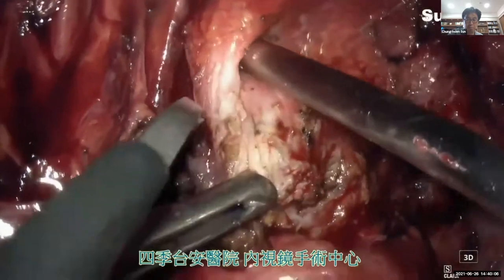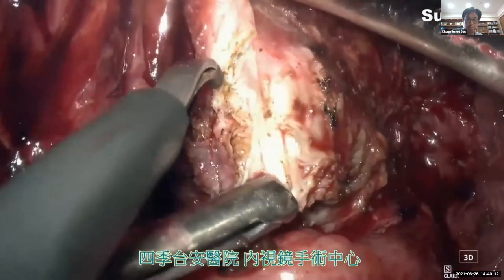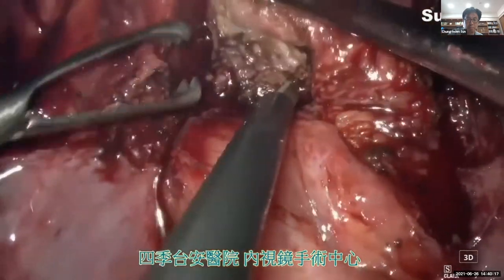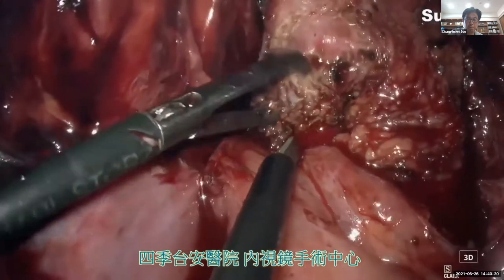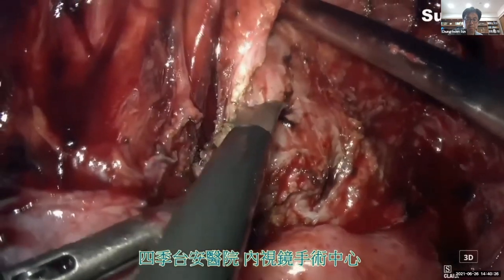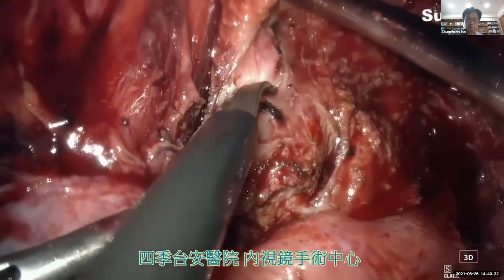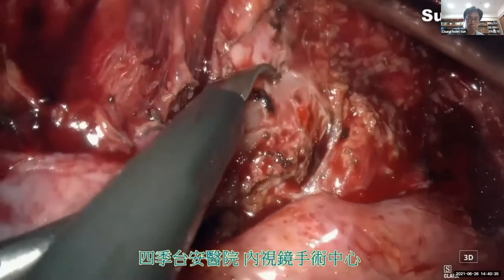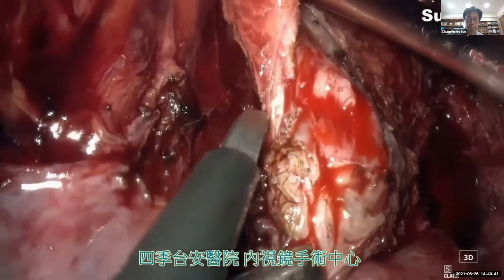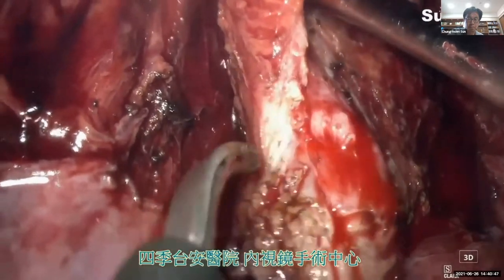Okay, we continue our shaving procedure. We are cutting the outer longitudinal muscle. I'm using the monopolar cutting current with short bursts so as to minimize the thermal injury to the residual healthy tissues. And now I'm using sharp scissors to make the cleavage plane between the muscle layer and the underlying inner muscle or mucosa. And again, it is very important to keep traction and counter traction.